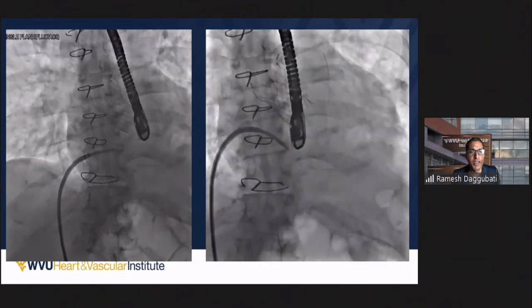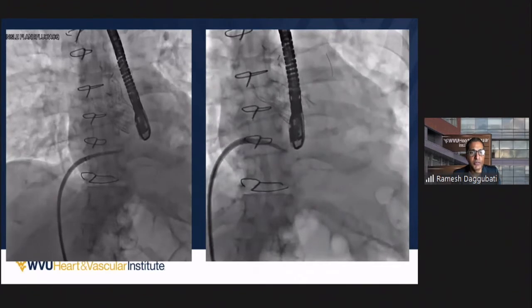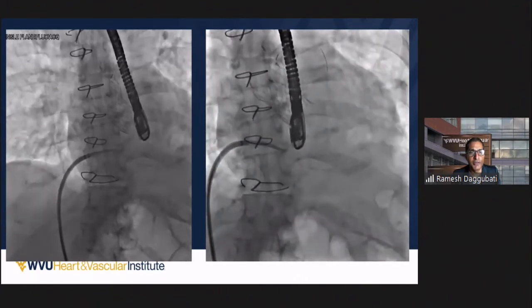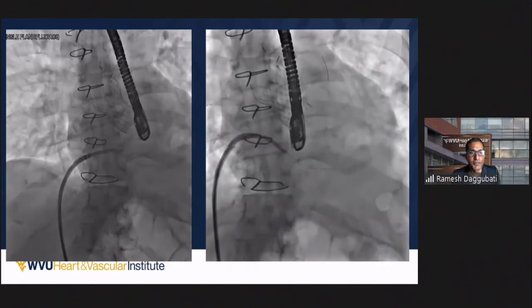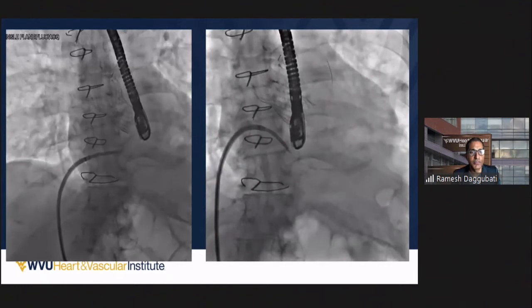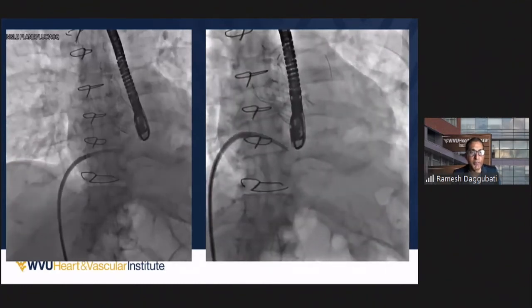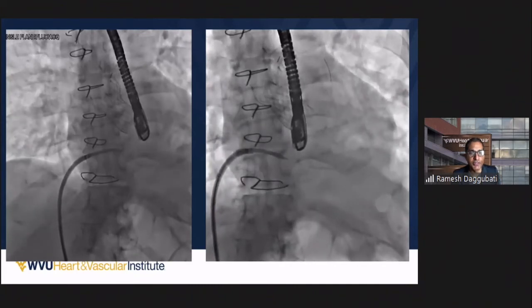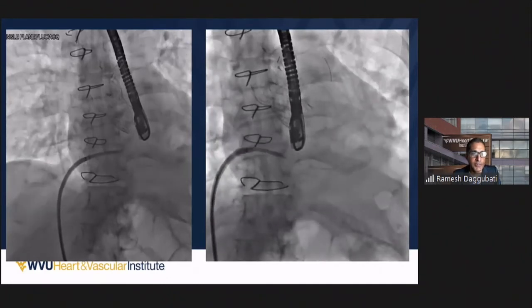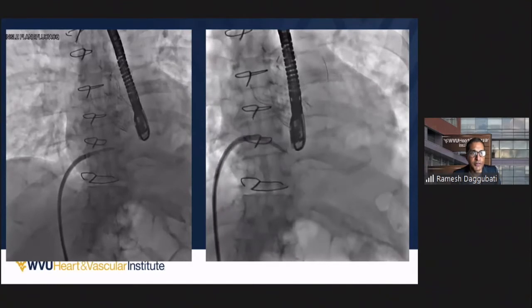This is a patient in whom I had a terrible time getting a transseptal puncture. You can see how much I was flexing it and trying to rotate it. The SafeSept wire was advanced and I had a lot of trouble. Finally, with the SafeSept wire, I was afraid of pulling it back because it kept coming back. But with a gentle tug on the SafeSept wire while advancing the transseptal SL1, we were able to do that easily.